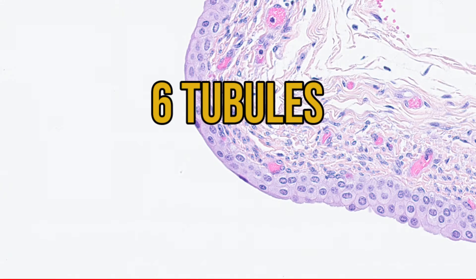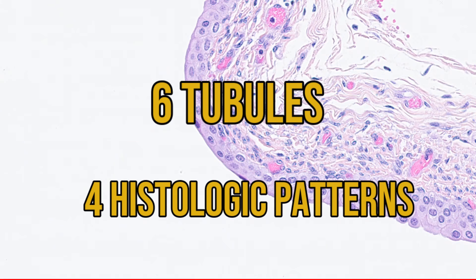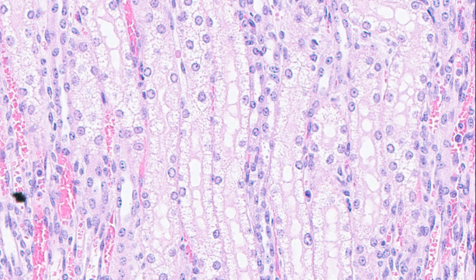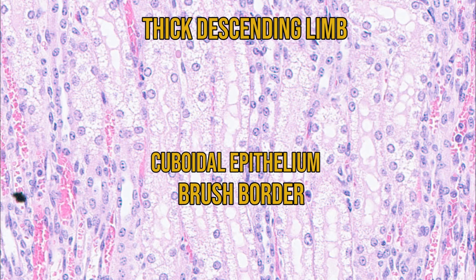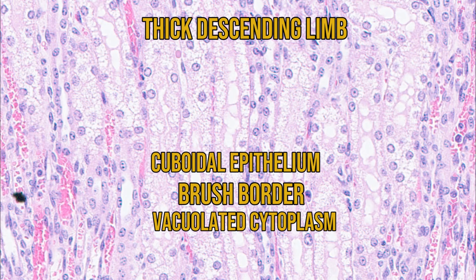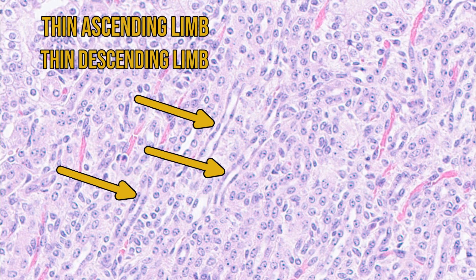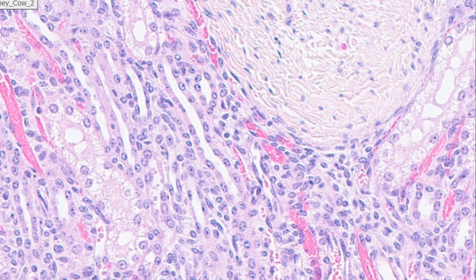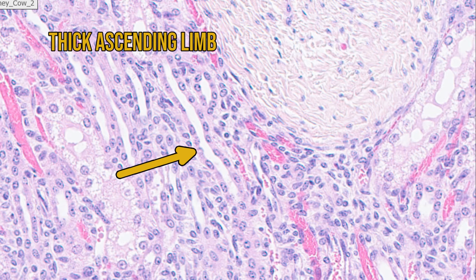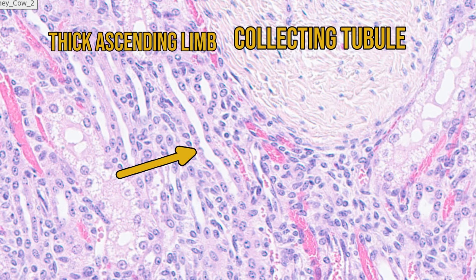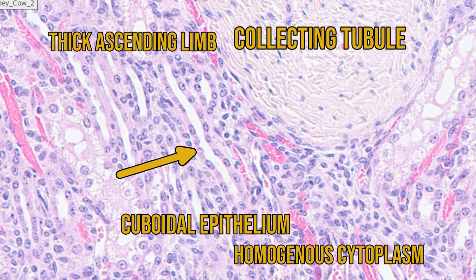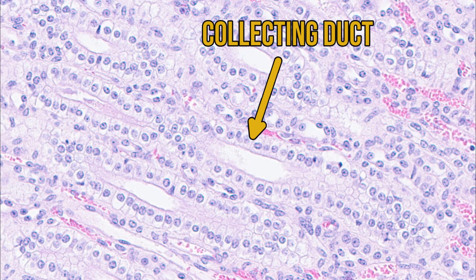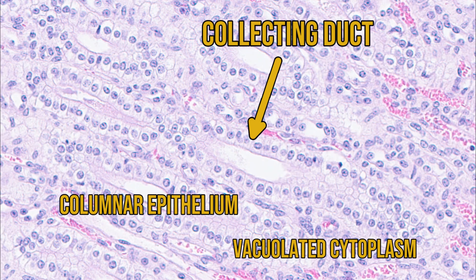Just to summarise, there are six different types of tubule you can see within the medulla, but of those, there are four distinct histologic patterns. First, the thick descending limb looks very similar to the proximal tubules in the cortex, with cuboidal epithelium that has microvilli lining the top and vacuolated cytoplasm. Then the thin ascending and descending limbs, lined by simple squamous epithelium — be careful not to confuse them with blood vessels. Next, the thick ascending limb and collecting tubules have epithelium similar to the distal convoluted tubule: cuboidal with no microvilli and more homogeneous cytoplasm. And finally, the large collecting ducts have columnar, vacuolated epithelium and are in general much larger.